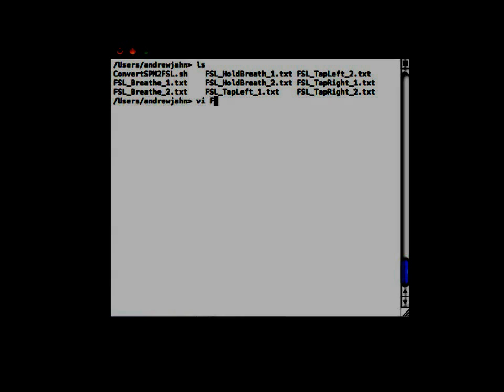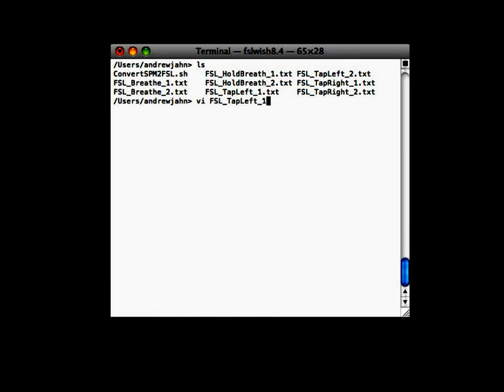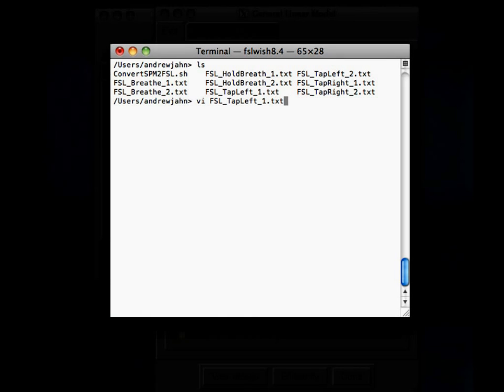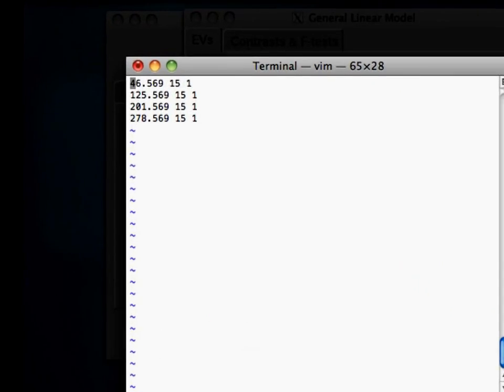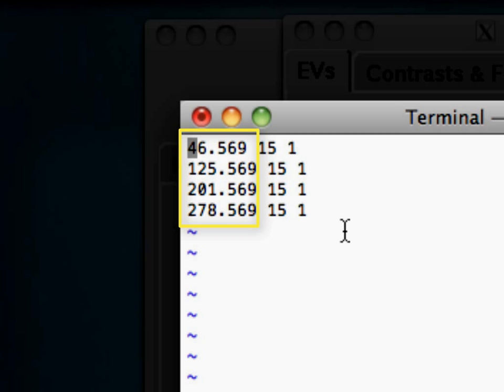If I just take a look in one of these, such as FSL tap left underscore one, the one stands for the first run, there are three columns here. The first column refers to when the start of the condition happened in seconds relative to the beginning of the run. So, in other words, right when the scanner started, 46.569 seconds into the run was the first occurrence of this tap left condition.